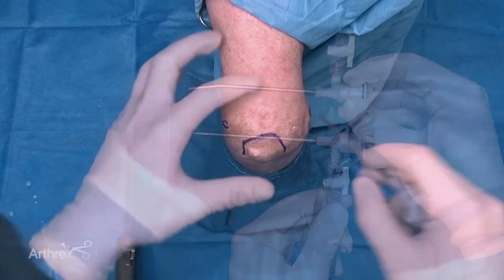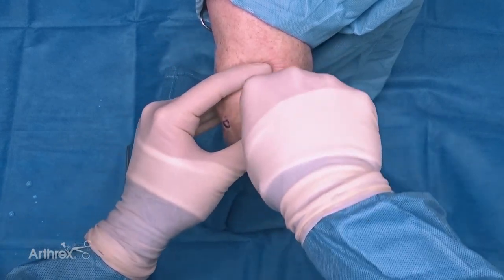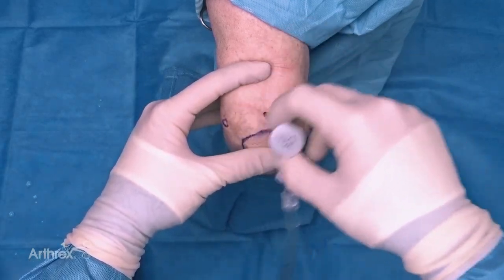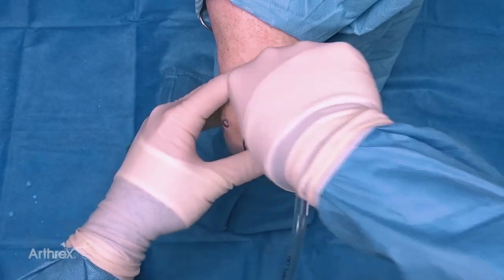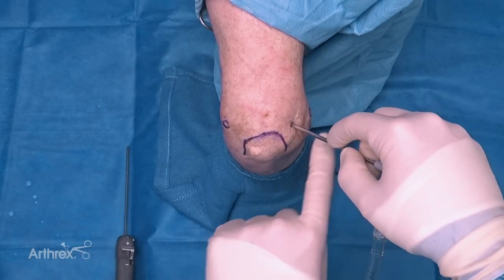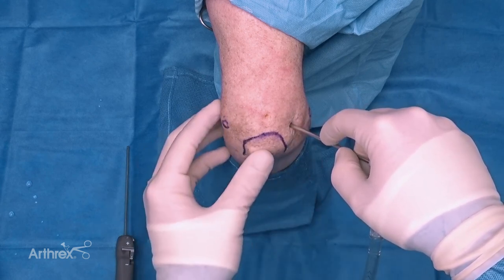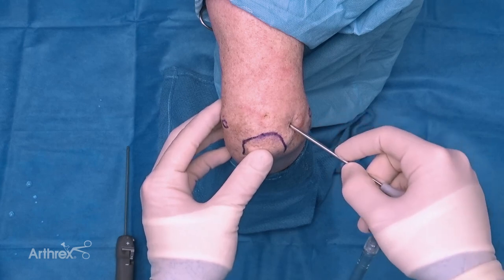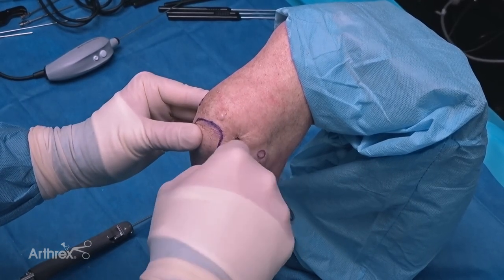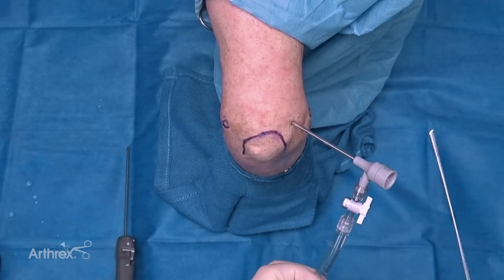We'll start by puncturing through the skin. I have a sharp trocar in this cannula, so I'm going to go through a trans triceps portal just to create the hole that I'm going to use as my working portal. Then I'm going to create a posterolateral portal - I'm at the midpoint between the lateral epicondyle and the olecranon, moved up approximately one centimeter just on the lateral border of the triceps. I'm going to punch through and aim for the olecranon fossa, then insert the nanoscope.